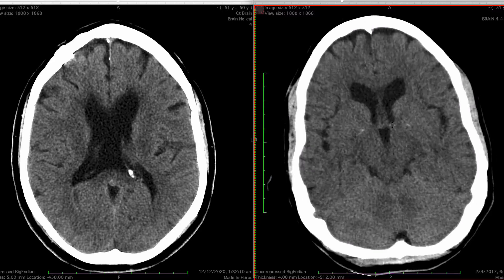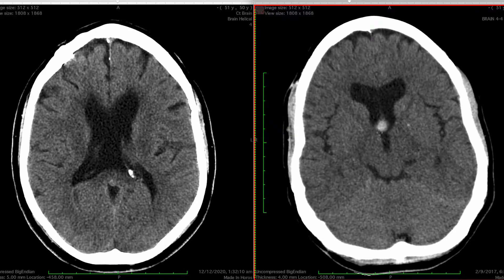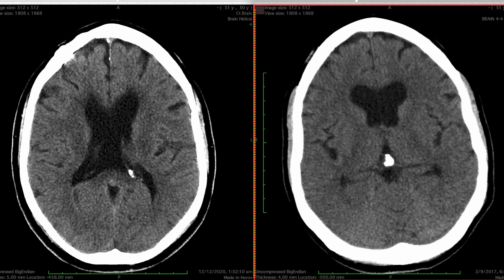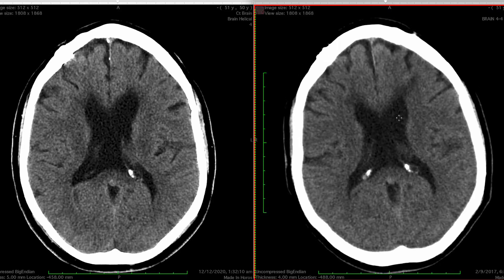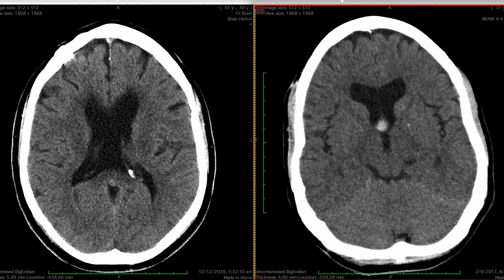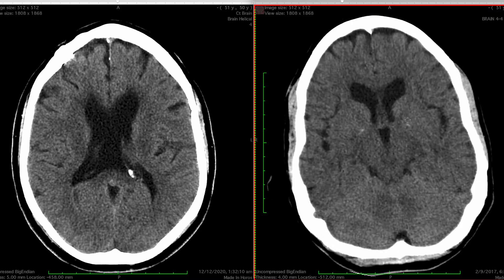This cyst is quite small, and it's important to look for complications arising from this colloid cyst. The main complication is obstruction. Our next job is to look for features of obstruction or hydrocephalus that we can see on a non-contrast CT brain. A quick and reliable way to assess this is to look for dilatation of the temporal horns of the lateral ventricles.